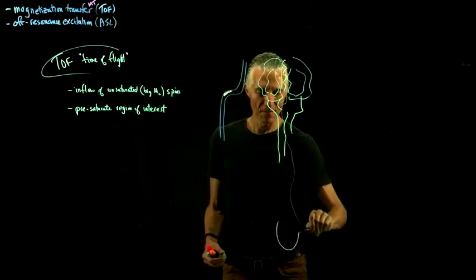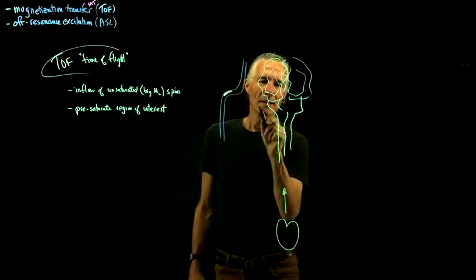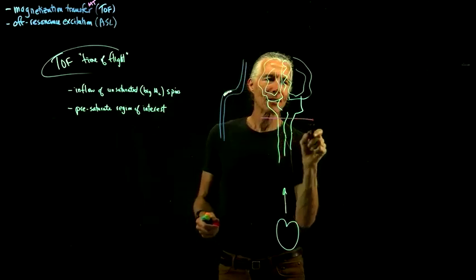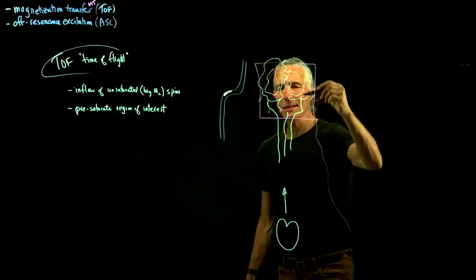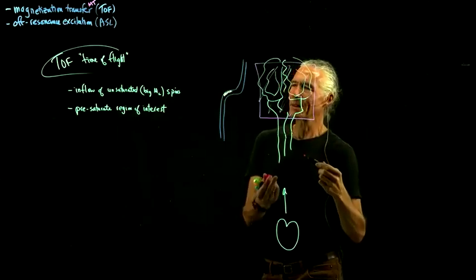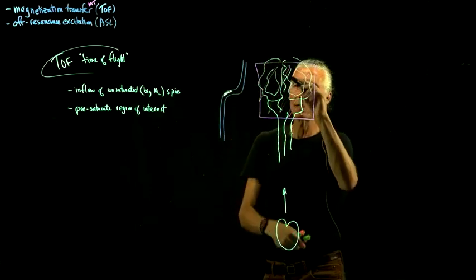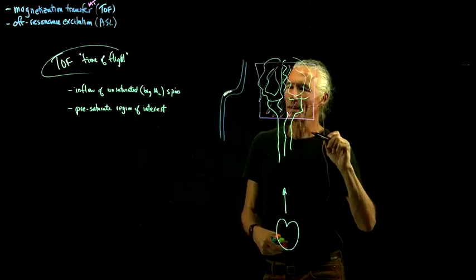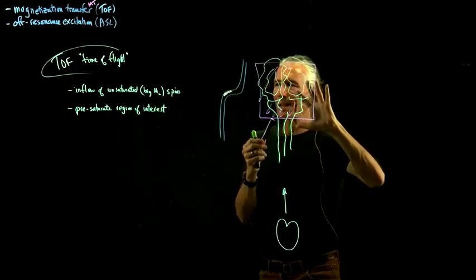There's the heart down there. Okay, heart. So what you do is blast off all this. So saturate that whole mess. So the brain, so any of the blood that's coming back down, because the brain goes, the blood, like Aristotle saw, blood goes up to the brain, and then it comes back down. So let's saturate all the blood that's in the brain, plus all the blood that's in the blood vessels we want to look at. And so that blots out that signal.